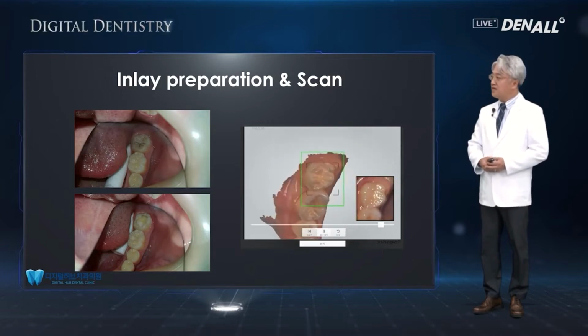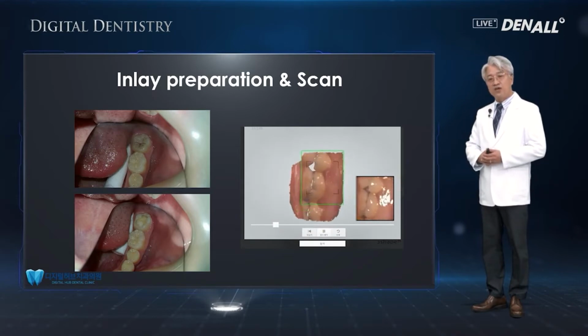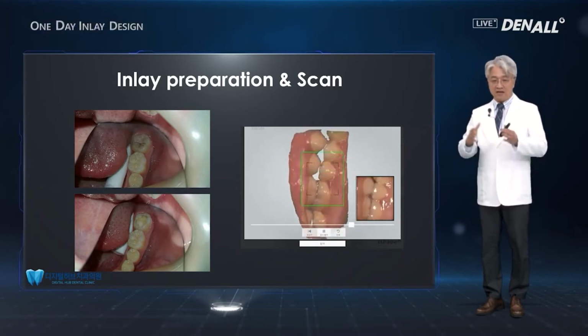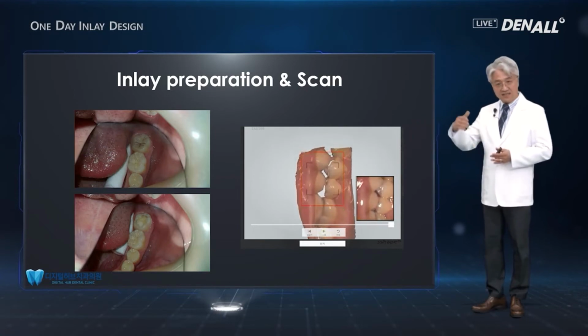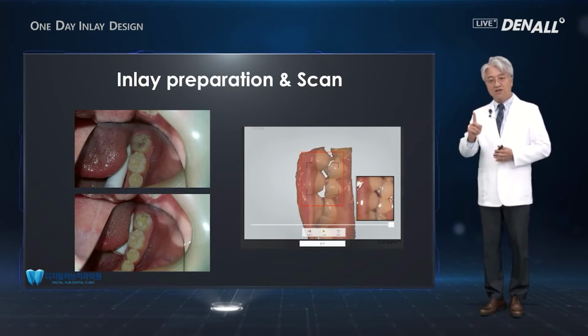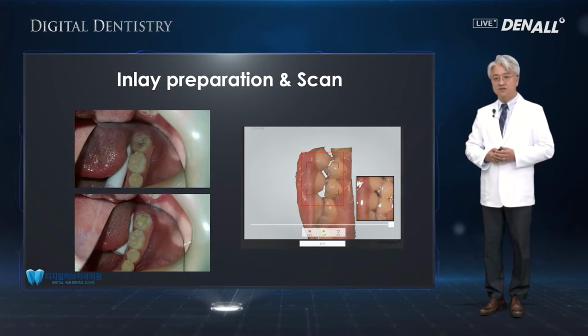So in inlay, the difficulty of scan is the least using the CAD-CAM. If you are using the CAD-CAM for the first time, then rather than doing other treatment, as you can see, it's easiest in terms of scanning. It's better to start with the inlay. So the CAD-CAM solution with the one-day concept is very feasible and easy to do compared to others.